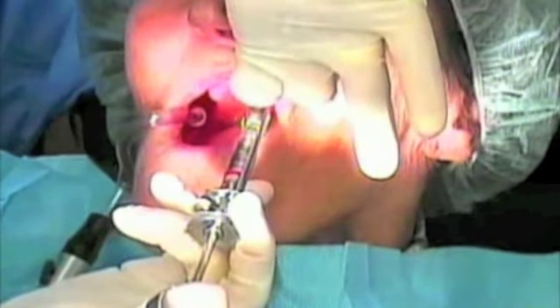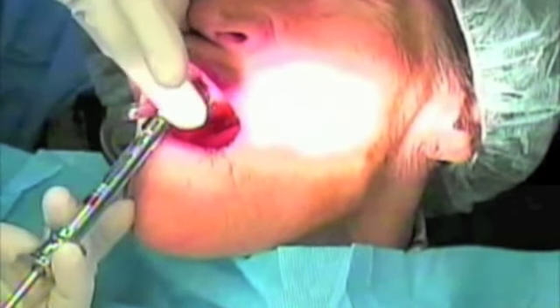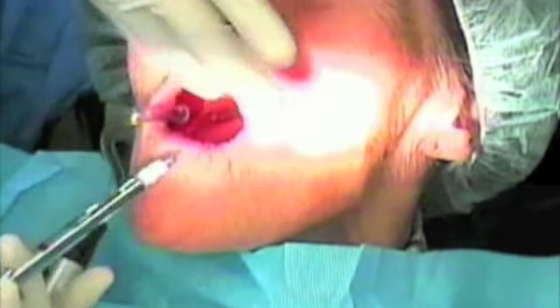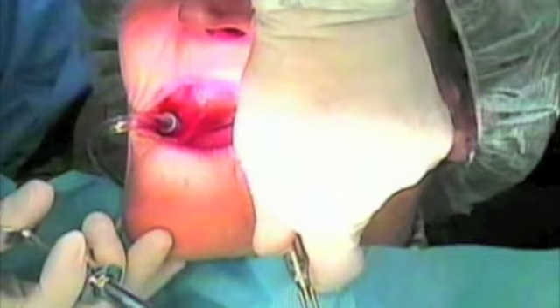The planning environment is based on the concept of representing a 3D medical image volume as a 3D scene. This approach bridges the gap between conventional two-dimensional radiological images and the actual view on a patient in the operating theater. In a 3D scene, you gain a good understanding of the patient's anatomy in relation to implant components, as well as to the prosthetic situation.